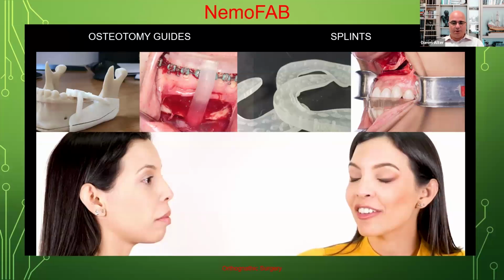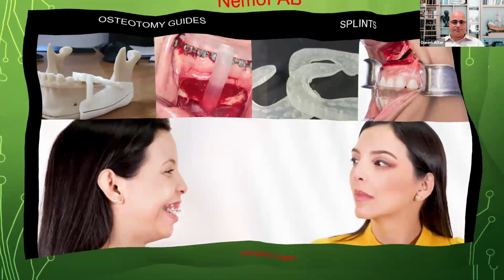And it's incredibly cost effective, being that it's a package on your local computer, and it's cloud-based as well. That makes it incredibly cost effective so that you can create these life-changing, dramatic opportunities for patients, whether it's osteotomies, surgical guides, implant prosthetics, orthodontics, and everything in between. It can really make a tremendous impact for your dental laboratory, your clinician, and ultimately our dental patients.